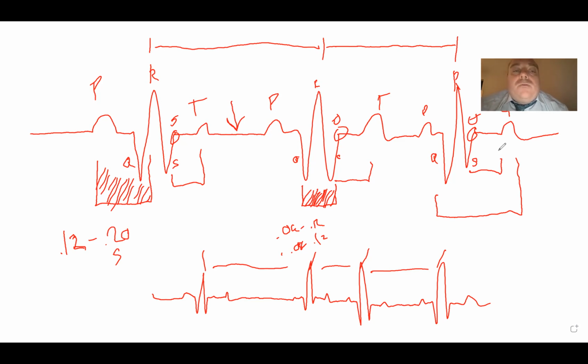Okay. So just a quick recap. We got P's, atrial depolarization, QRS's, ventricular depolarization, T waves, ventricular repolarization. We got a PR interval, which should be 0.12 to 0.20 seconds, and that's the time from atrial to ventricular depolarization. We have QRS width, right? Should be basically 0.06, 0.08 to 0.12. Once again, we're looking at that 0.12 number. We want it to be under 0.12. That's narrow.